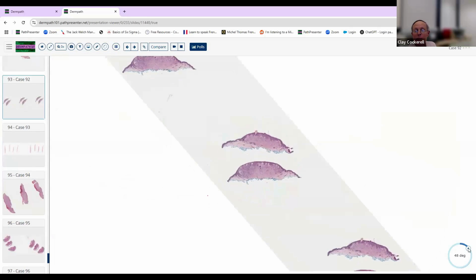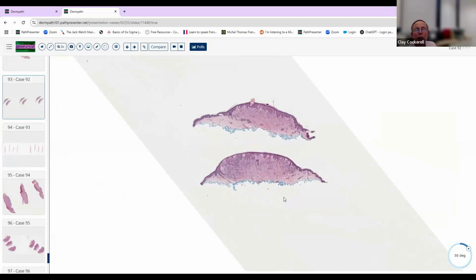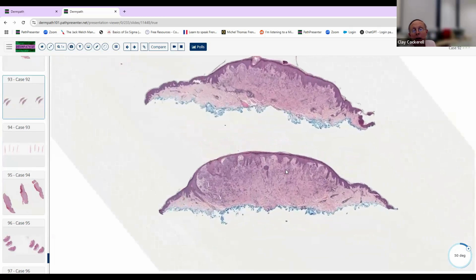Okay, we're not going to stay. We're going to make you flip around a little bit and not just go from one bug hunt to another. So here's a neoplasm, shave biopsy, small, symmetrical, well circumscribed. What kind of differentiation? Nested, maybe melanocytic. Kind of a type of epithelium.